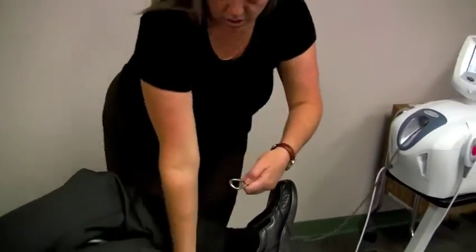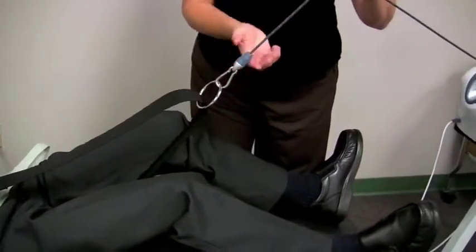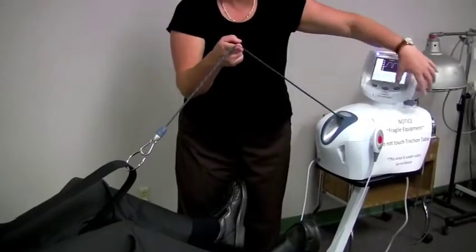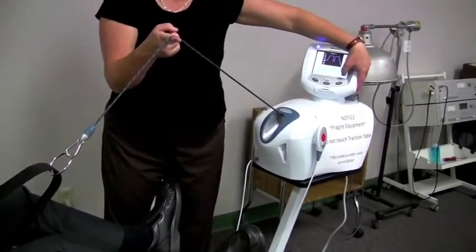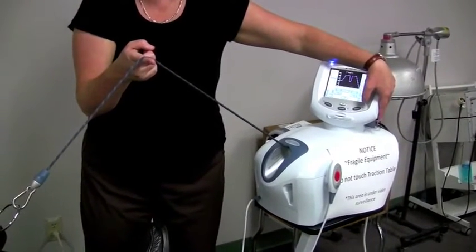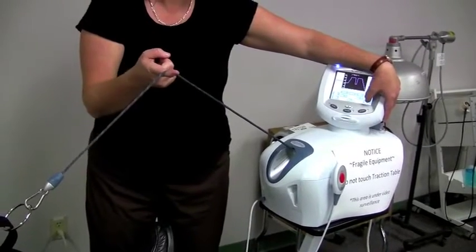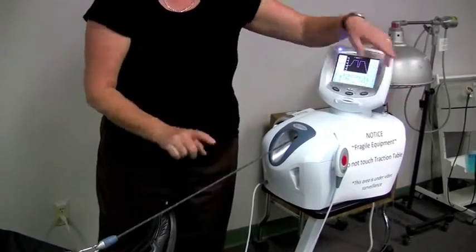And now I'm going to hook it right on the ring. Okay? Now watch how I have my finger right here. Watch how I do my finger here while I'm going to over here push the rope release. So just watch my finger. I need to make sure not to snap it down too quickly, because then that would pull the muscles in the patient, and potentially that strap could hit the patient and it wouldn't feel good. So slowly lower the rope. Now it's kind of tense.